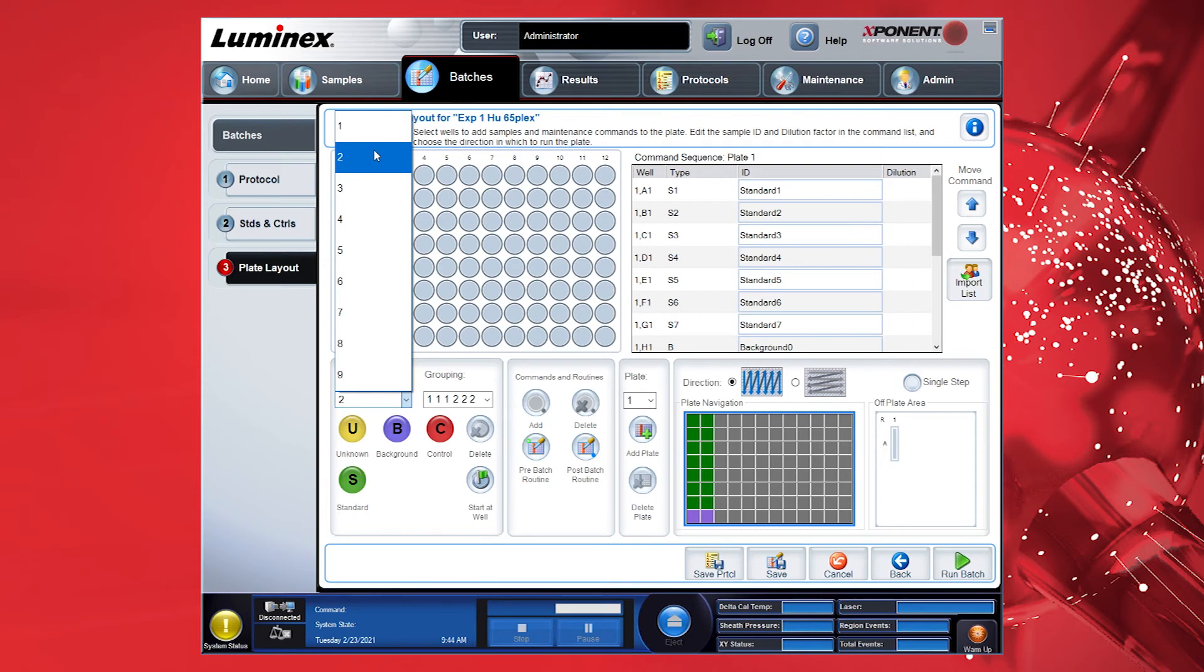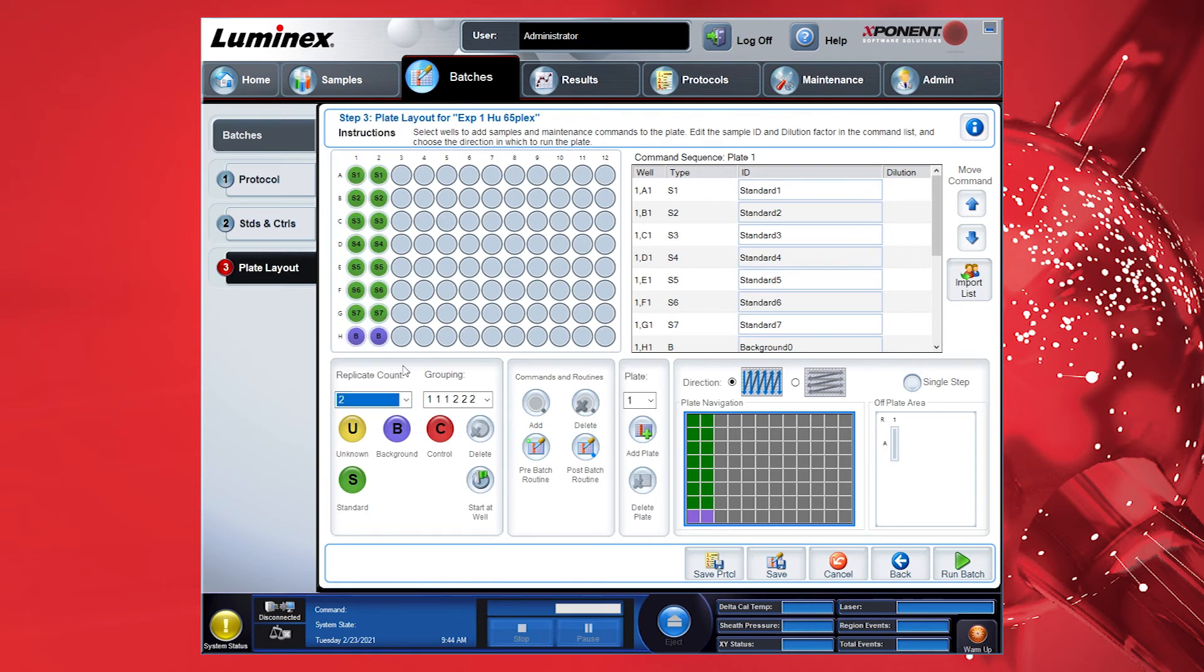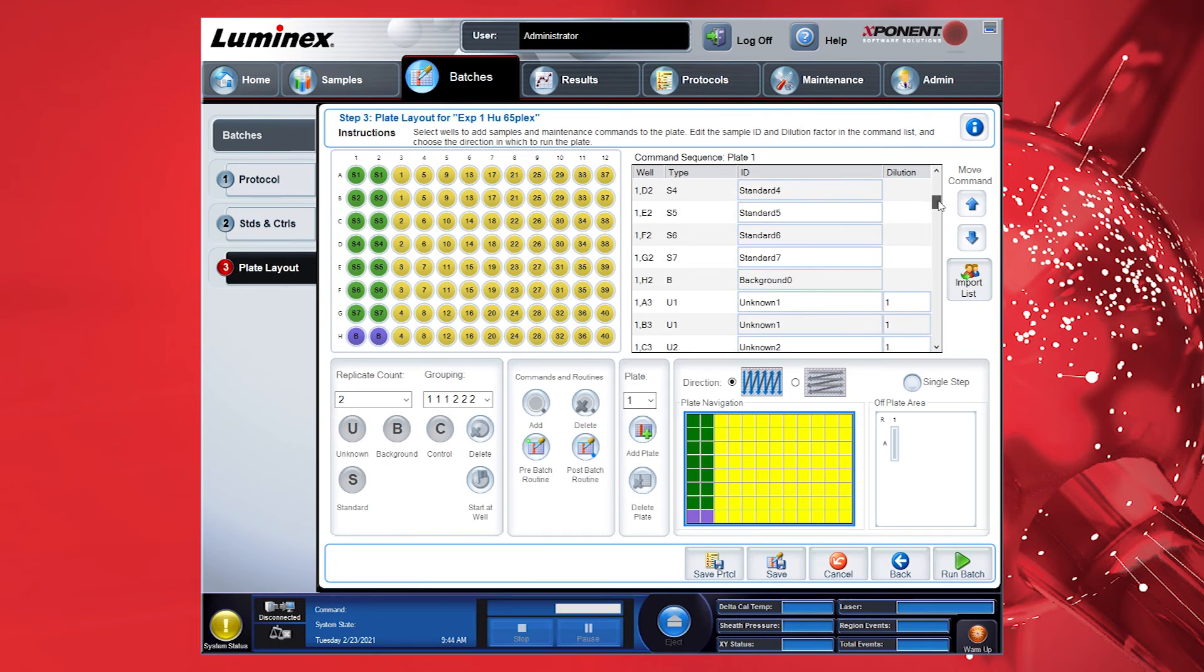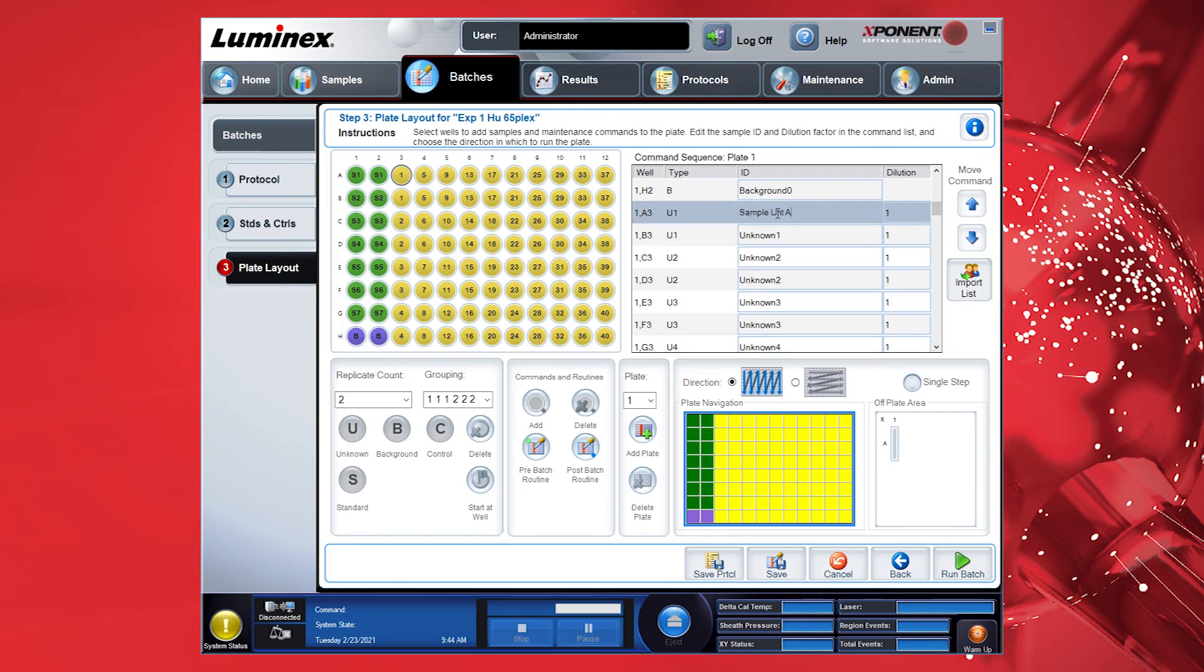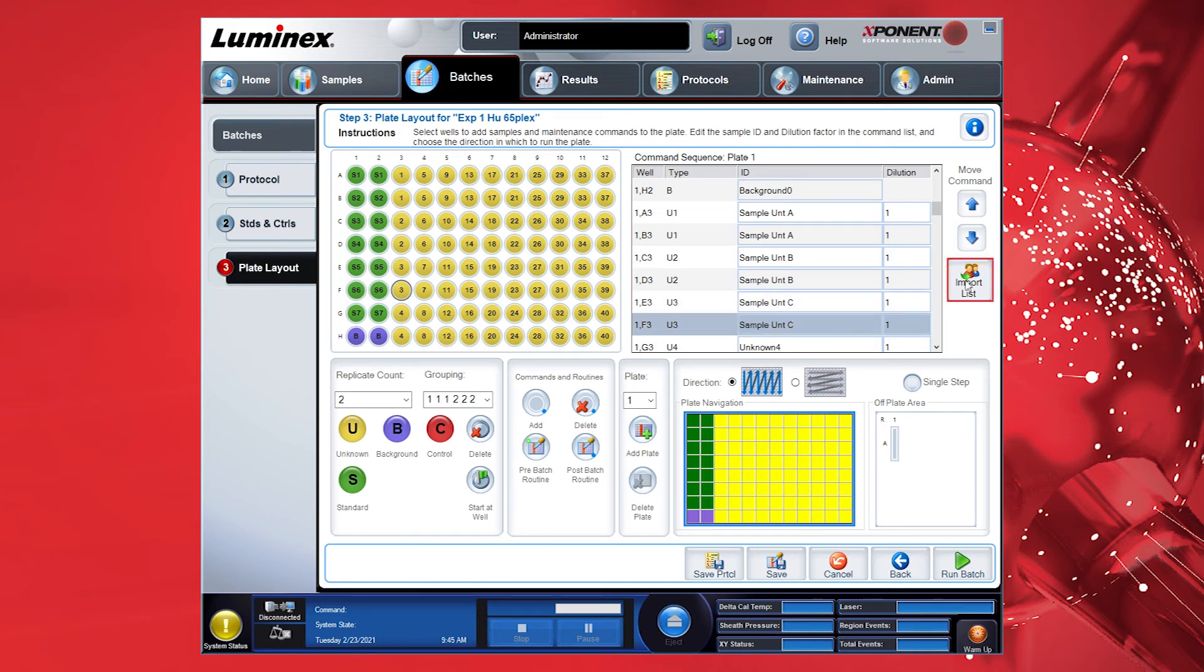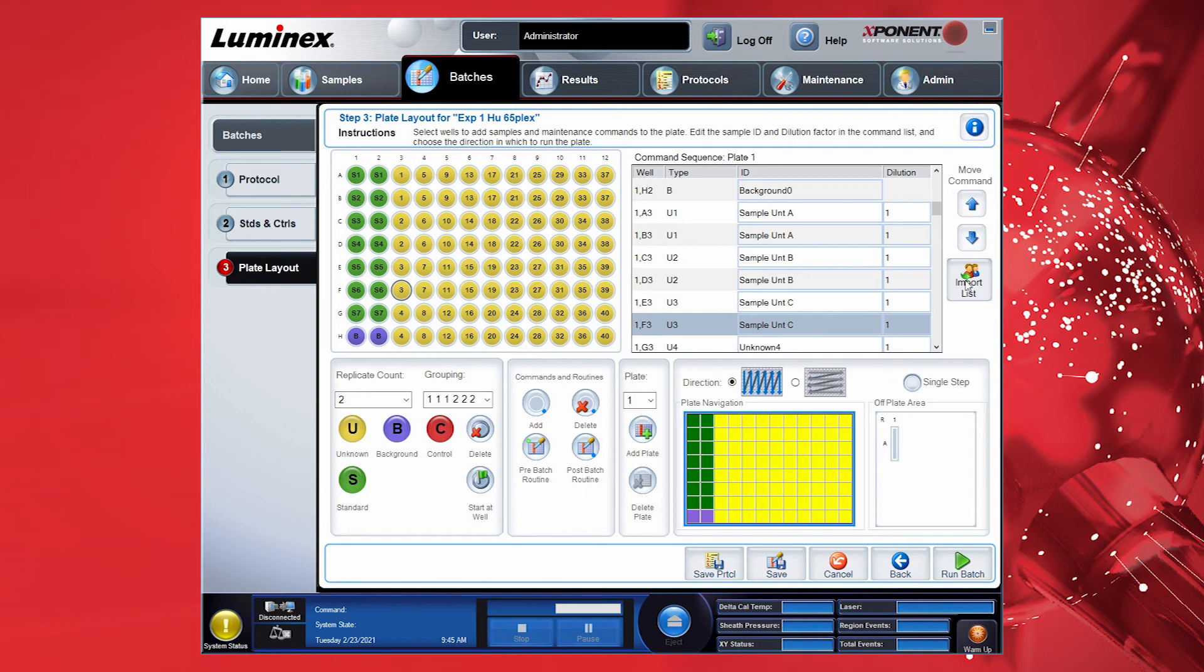Now you will see the plate layout that was created previously in the Protocol section. Define your unknown samples on the plate and apply the appropriate grouping. You can include the names of the samples and a dilution factor if necessary. You can also use the Import Sample List option to import a list with the complete names of the samples and the dilution factor with a text file. If you want to start reading the plate at a later time, click Save for saving the batch information. Then load the plate into the instrument and select Run to start reading the plate.